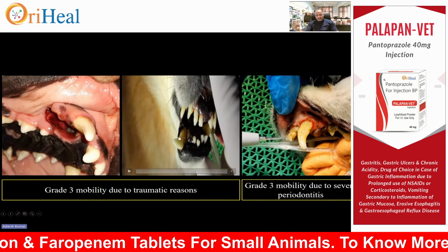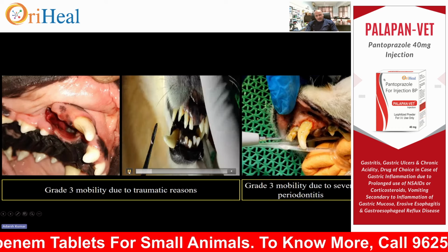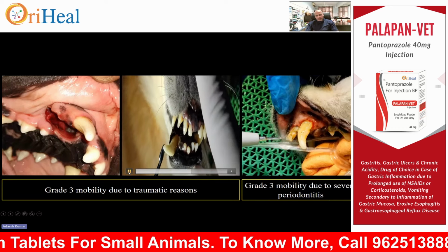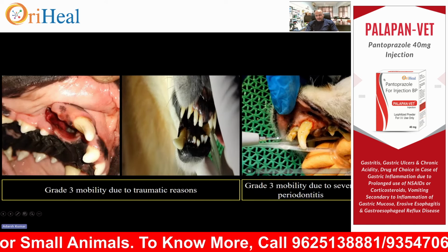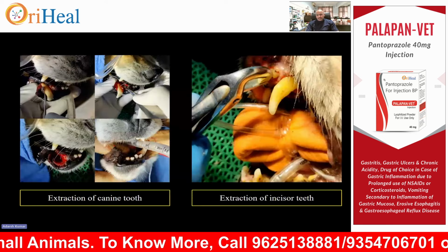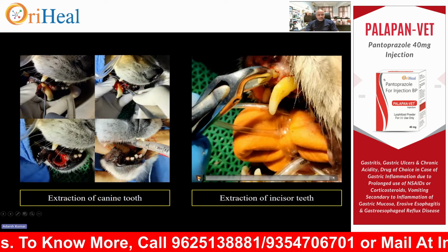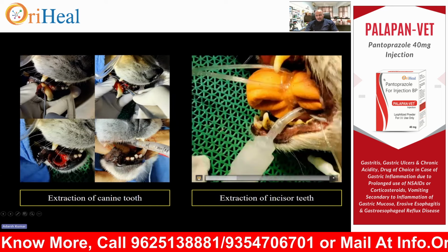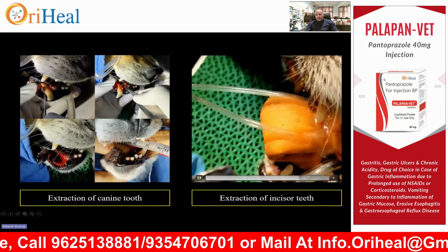So you don't need a flap here, right? You don't need a flap here. Just look at this. You don't need a flap here. So it comes out. Okay. So this is not surgical extraction. This is simple extraction. So likewise here also, see here, this is the extraction of the incisor. This is the non-surgical extraction. You are not creating a flap.